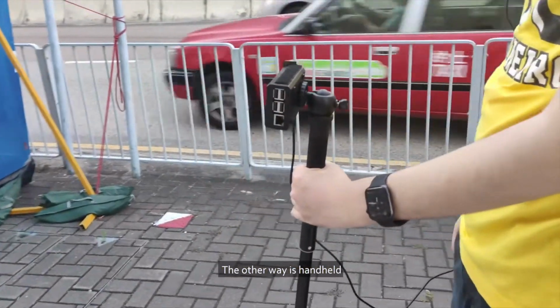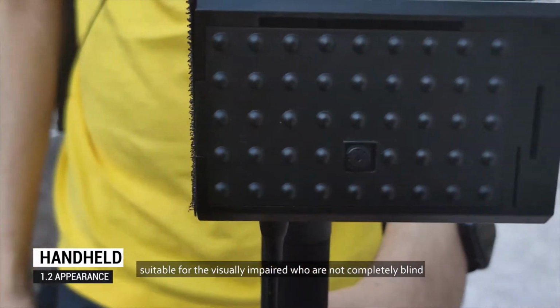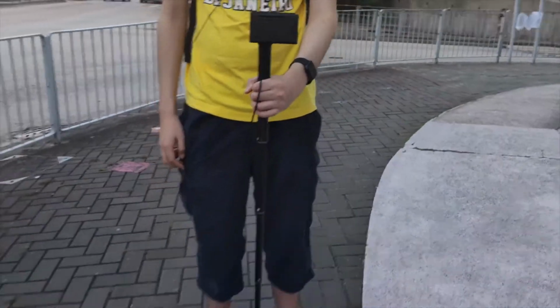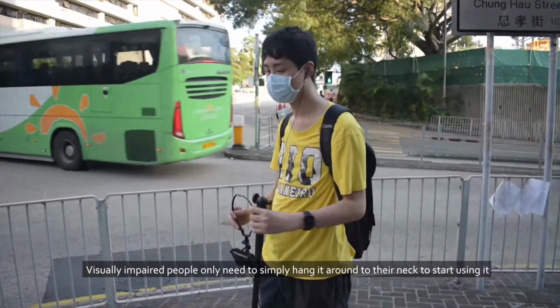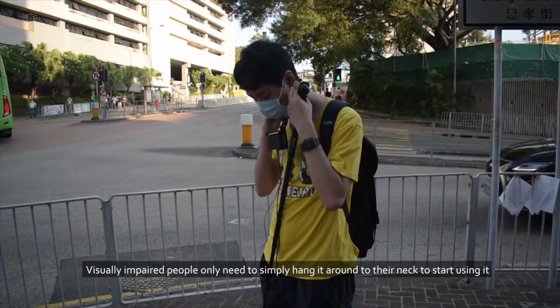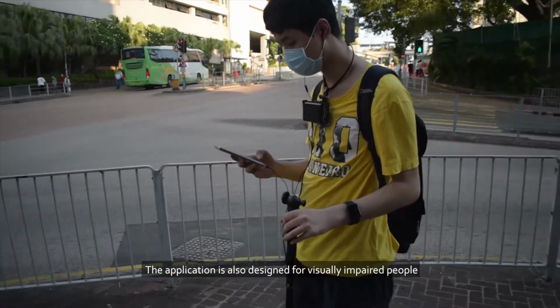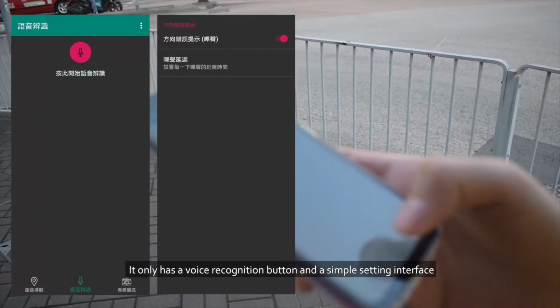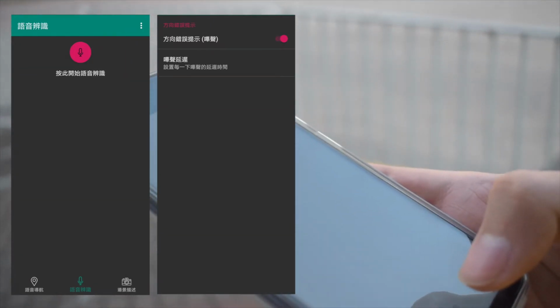The other way is handheld, suitable for the visually impaired who are not completely blind. Visually impaired people only need to simply hang it around their neck to start using it. The application is also designed for visually impaired people. It only has a voice recognition button and a simple setting interface.